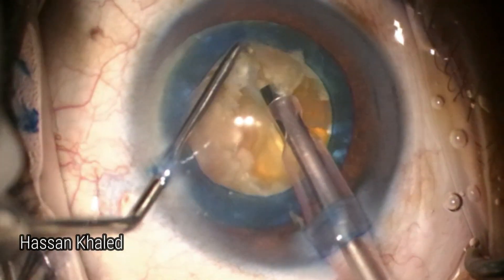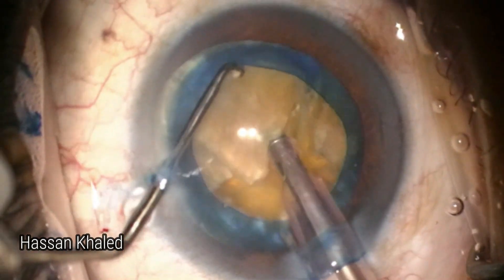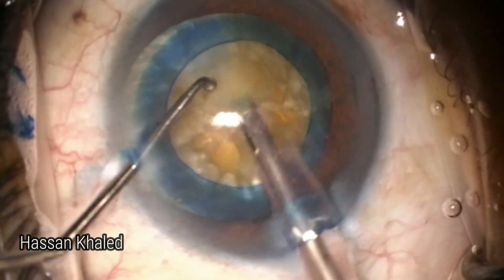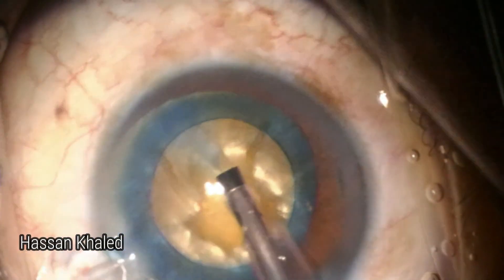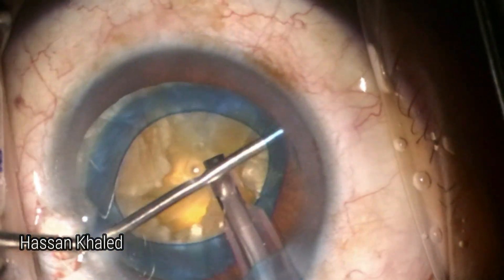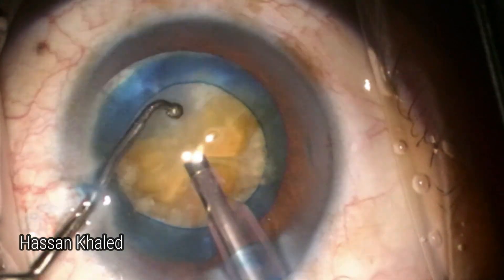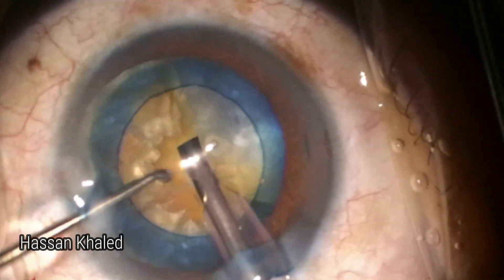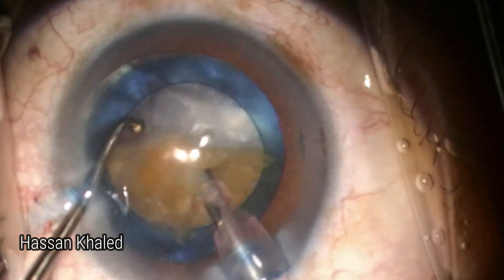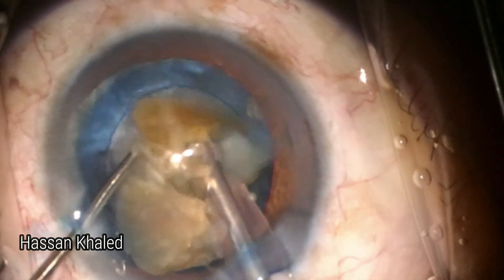As we can see, I chopped this dense brown nucleus into two small fragments, then emulsifying each fragment alone with multiple injections of dispersive OVD. We can see throughout the emulsification of this dense nucleus the OVD protecting the back of the cornea, as we need high ultrasonic energy to emulsify this brown nucleus. Here is the last fragment.